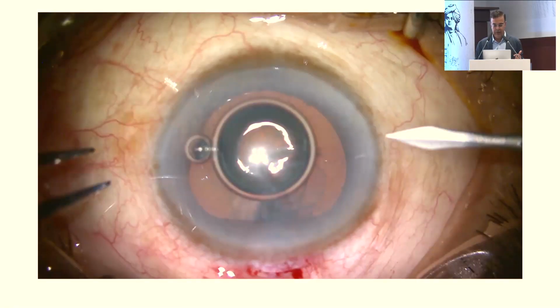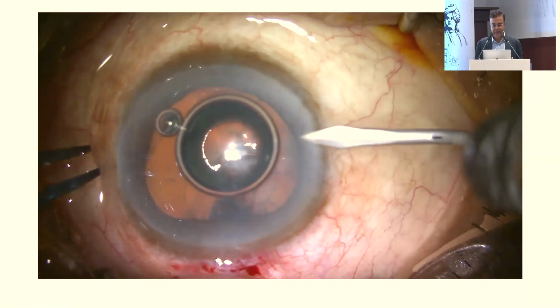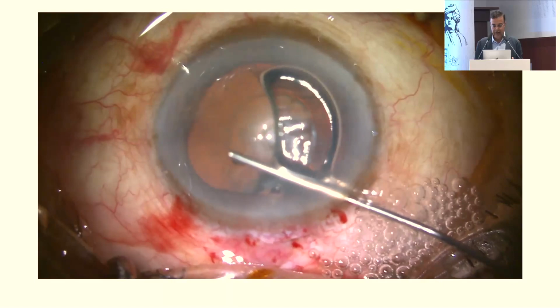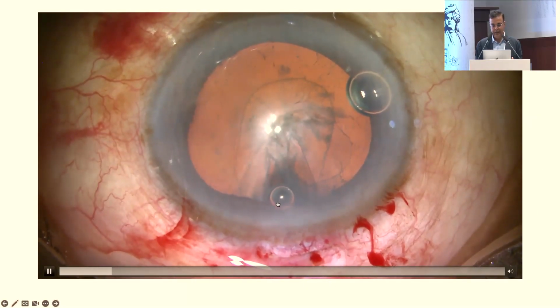So this was a patient referred to me. Somebody had started a surgery and had a runaway rhexis, was a learner surgeon and didn't want to pursue it further. So the patient was referred to me, and there was a run out in this area.